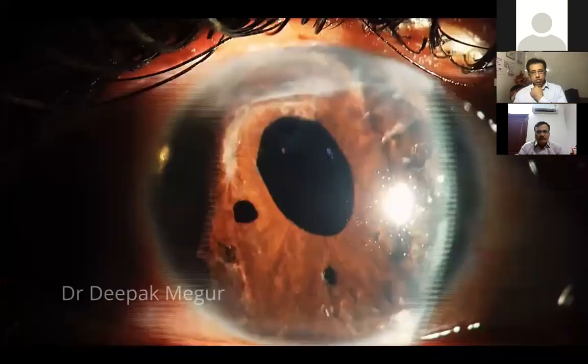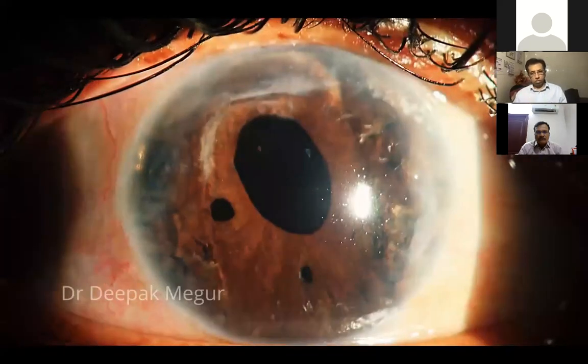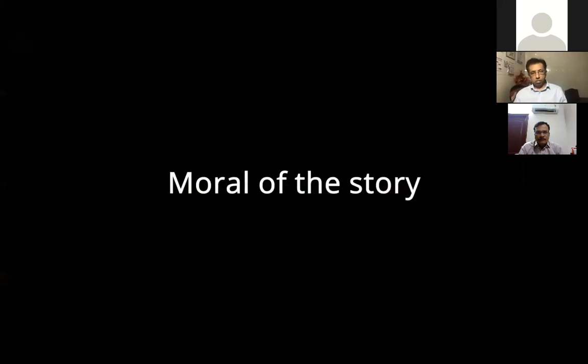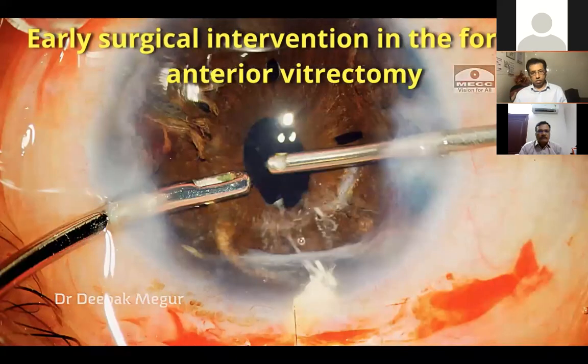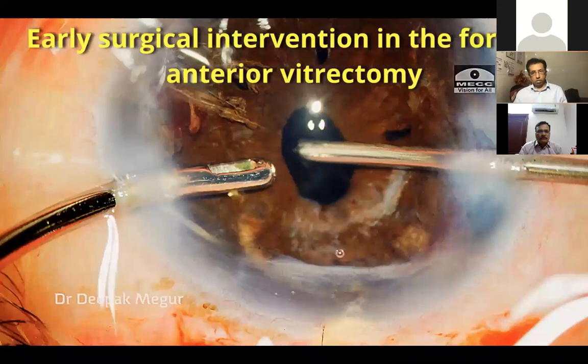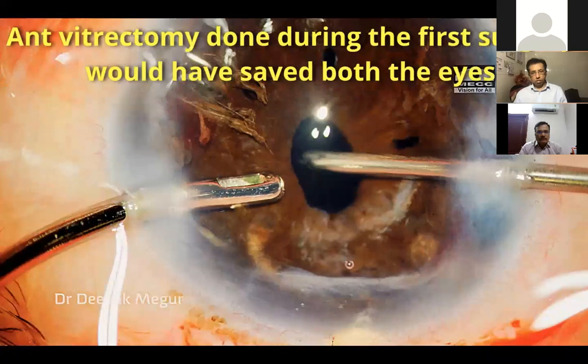Two months later, the corneal decompensation seems to have halted but secondary angle-closure glaucoma is not under control. She eventually requires a glaucoma drainage device. The moral of the story is that early surgical intervention in the form of anterior vitrectomy could have definitely yielded better outcomes, as was evident in the previous case.